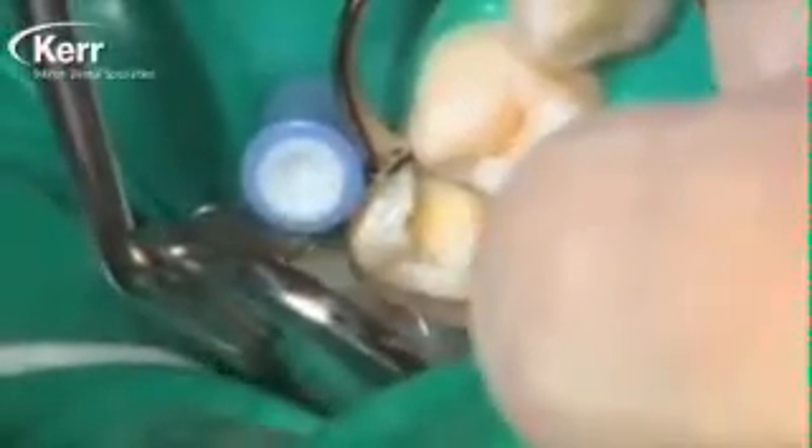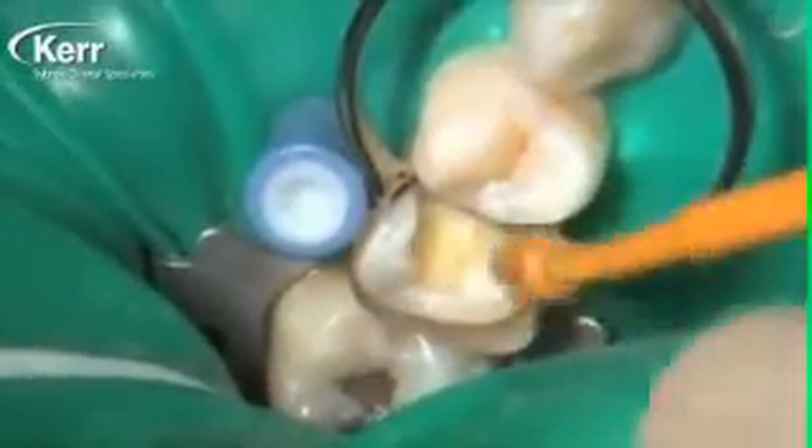We fill about a third of the preparation with the Dyad Flow as you see here, and then we use the enclosed brush to thin the material and move it up the cavity wall preparation towards the enamel margin. We're spreading this all around, thinning the material, but at the same time coating the entire inside of the preparation with the Dyad Flow. This is really important — we want to cover all the tooth structure, whether it's dentin or cut enamel, with the Dyad Flow.